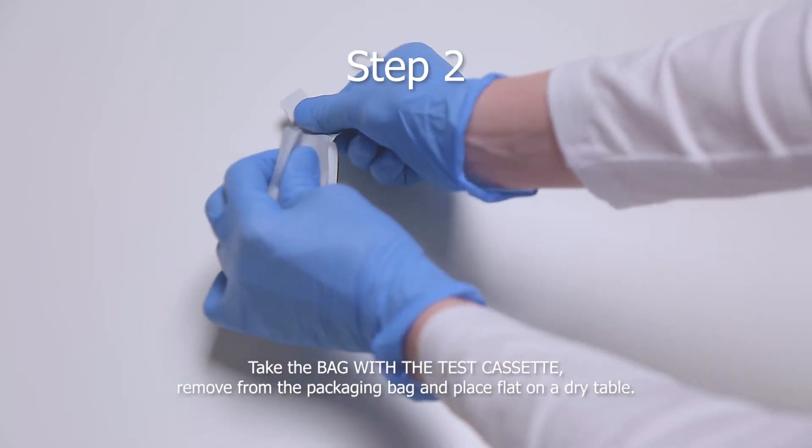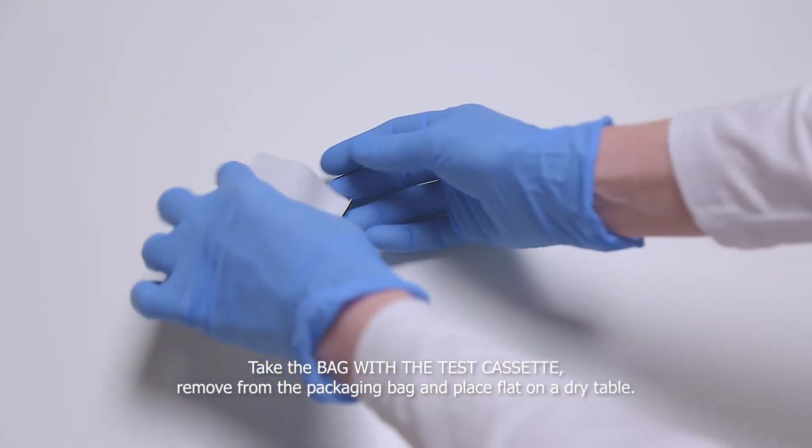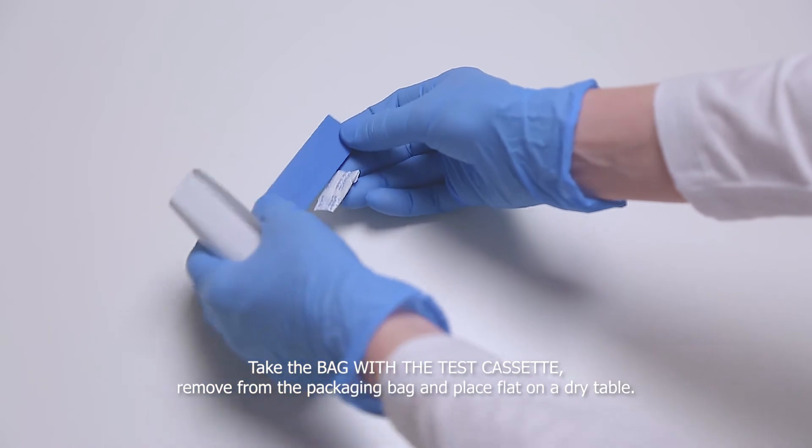Step 2. Take the bag with a test cassette, remove from the packaging bag and place flat on the dry table.